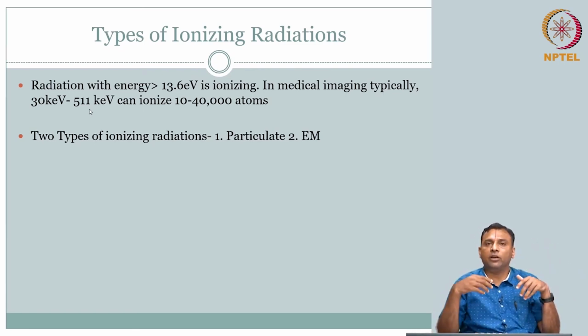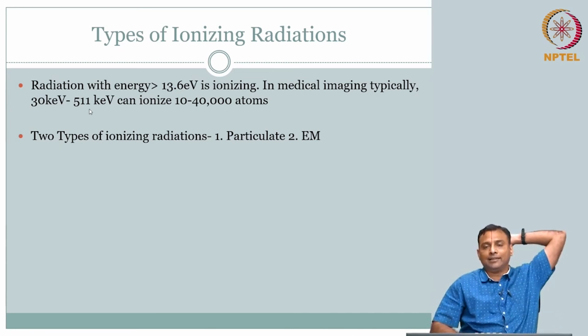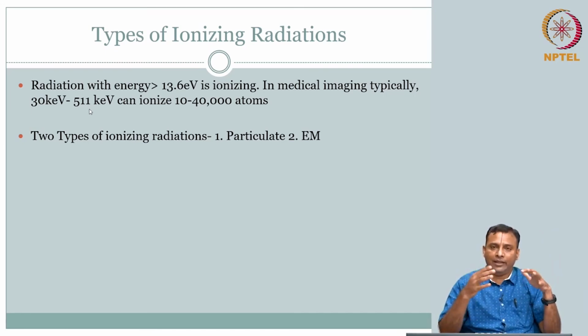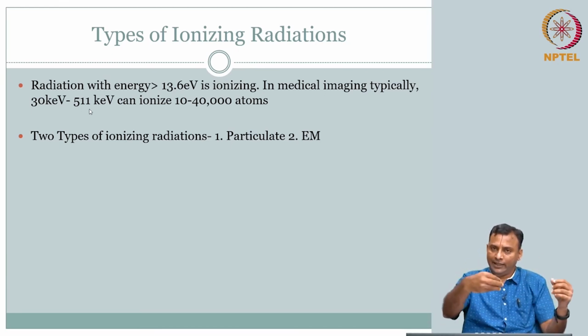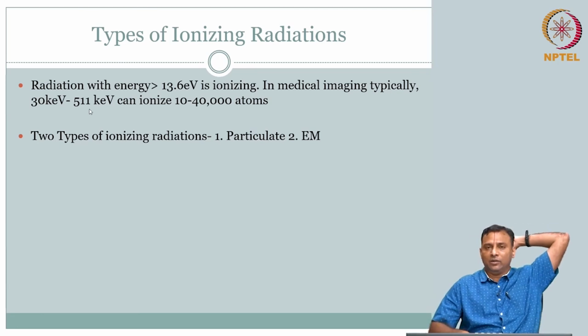So in some sense we are talking about transmission. We are sending X-ray energy through the body, and what comes out on the other side is detected. In gamma imaging also, in some sense, that is what we do. The radiotracer is going, and the radioactivity energy is coming in a different range, say gamma energy, but it is coming out from inside to outside, through the tissue. In X-ray imaging, we generate the X-rays outside, send them through the body and collect them outside when they exit the body, correct?